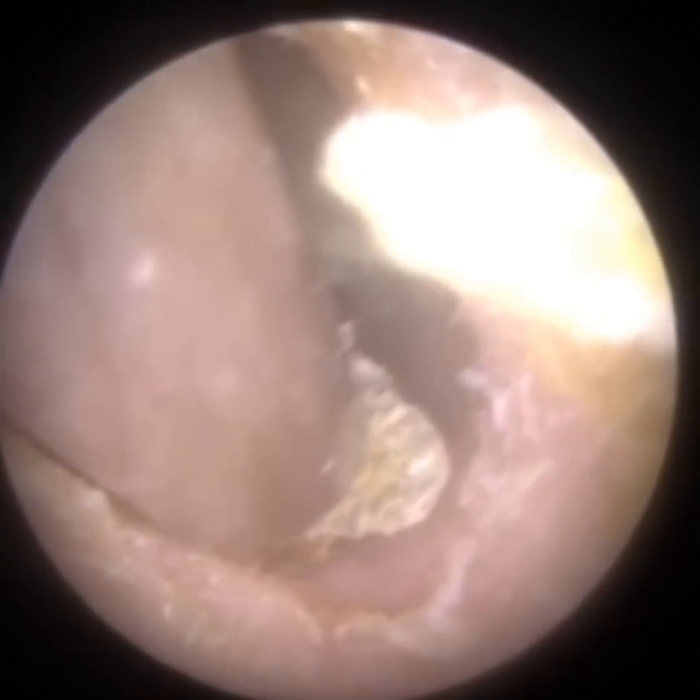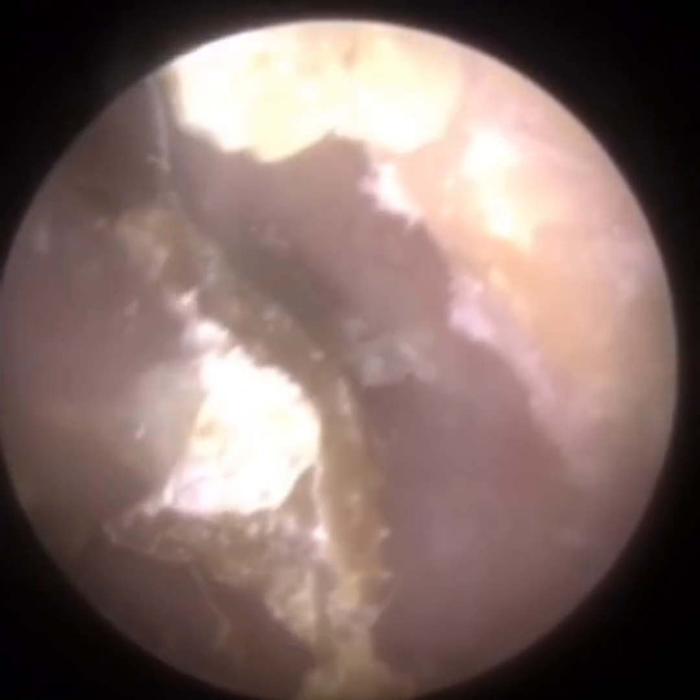Just going back in with the suction to see if I can bring this a bit further forwards. I think in a moment I'm going to use some forceps to extract it outward laterally, and then use the hook in combination.